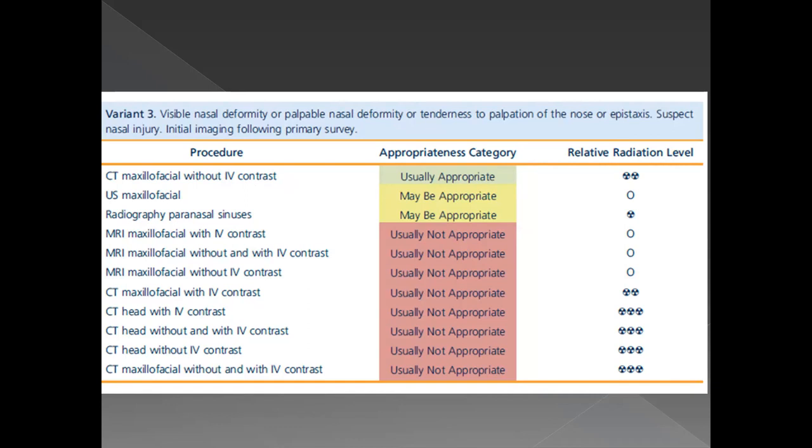Ultrasound has also been found to be appropriate in diagnosing undisplaced fractures. So that has a role again, but since we maxillofacial surgeons are not very comfortable or have any idea regarding how to interpret an ultrasound of the maxillofacial area, you are probably best placed ordering these plain X-rays and basing your diagnosis on that.